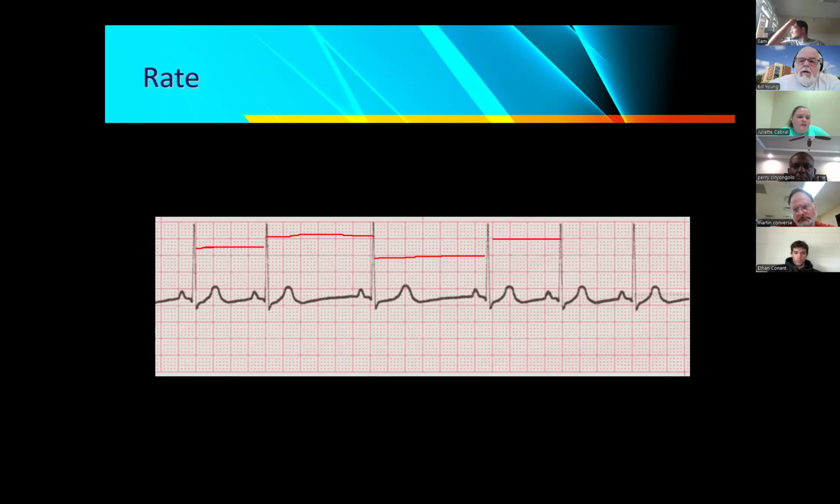Well, I mean, based off of timing, it looks like 4 big boxes, 6 big boxes, 7 big boxes, 4 big boxes. Excellent. So what we're doing is we're seeing, as we're starting out with this one right here, we see that's our baseline. So we come over here, this one's longer. Then we come over here, this one is longer. And then we go back to pretty much what we saw over here in the first one. So we see a progression and then it comes back.